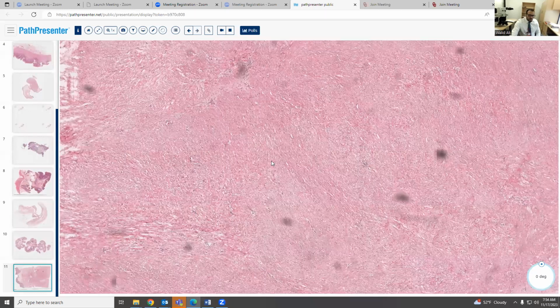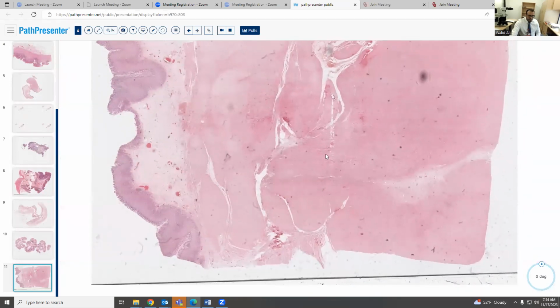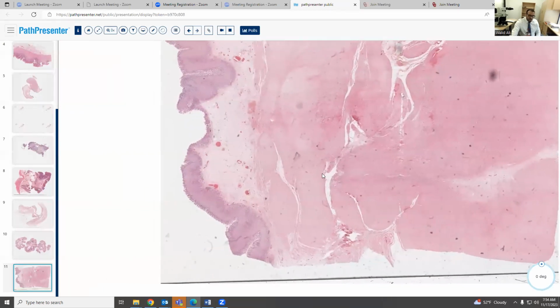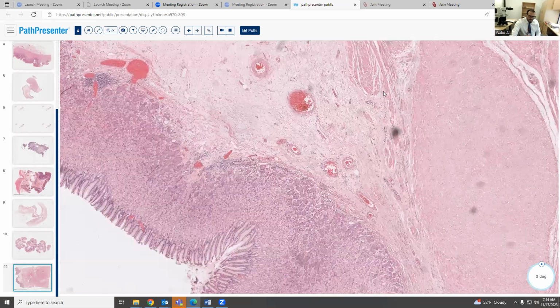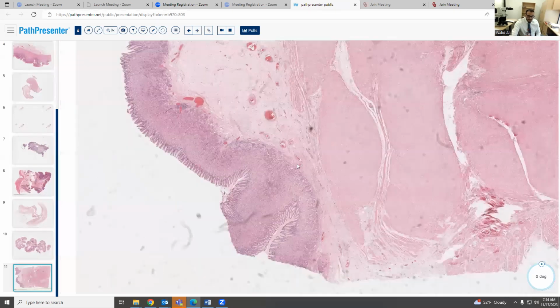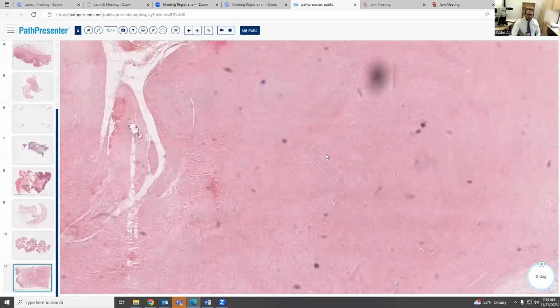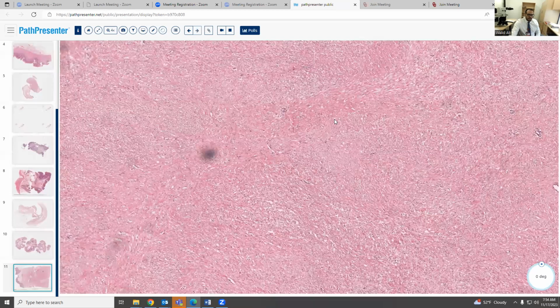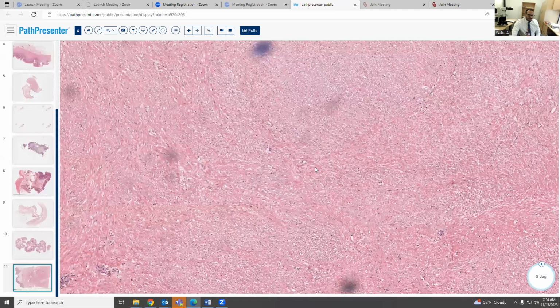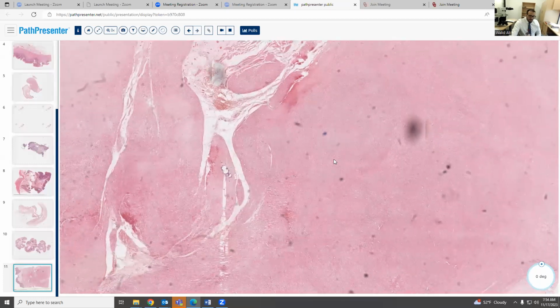So this is very common also in the GI. This is leiomyoma, actually arising in the GI, like here, in the stomach. This one can happen. However, leiomyoma is more common in the esophagus. But we can see here, at high power, eosinophilic intersecting fascicles of spindle cells, and eosinophilic cytoplasm. So this is also a very common mesenchymal tumor.